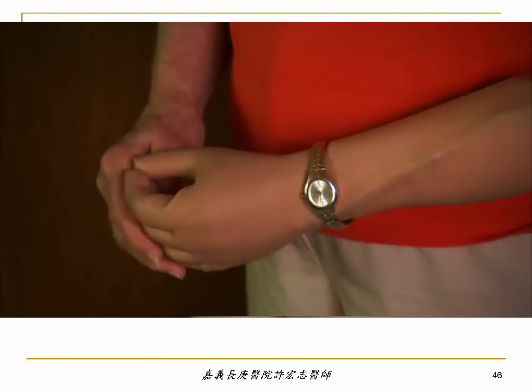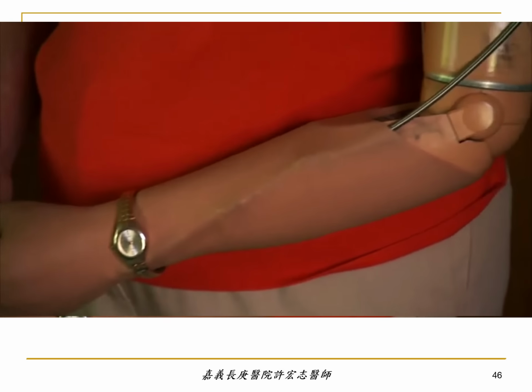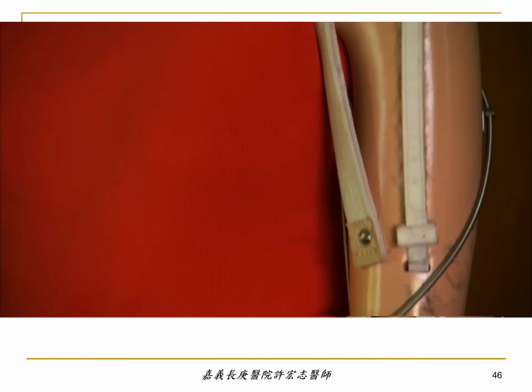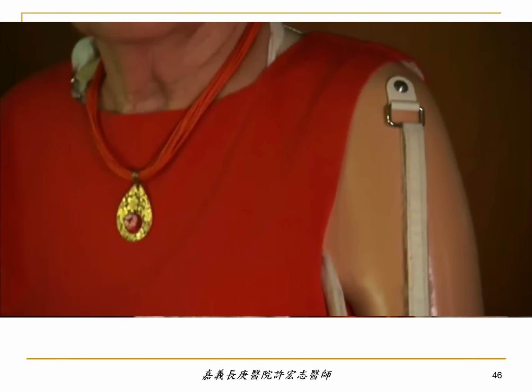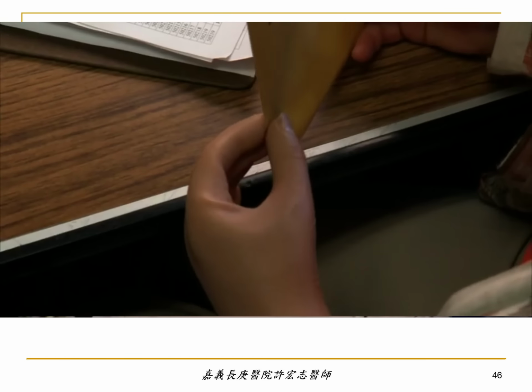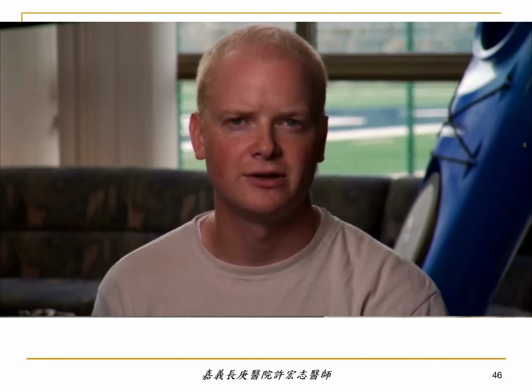My prosthetic device is an artificial arm with a hand, and then I have a mechanical elbow, and it comes up over my shoulder, the plastic part does, and I have a strap that goes around my neck and under my arm. With my shoulders, I can open and close my hand to some extent and pick up things. I've had a whole assortment of terminal devices that go on the end of my arm.